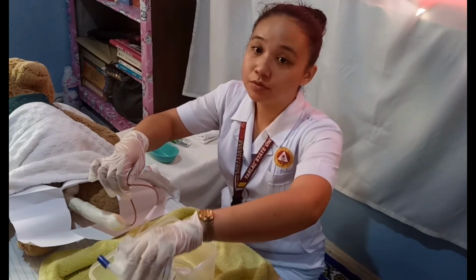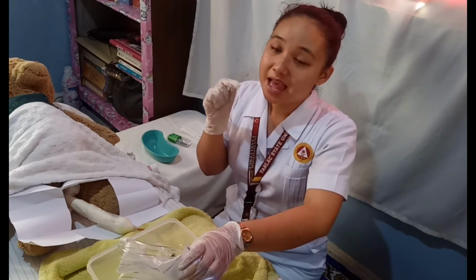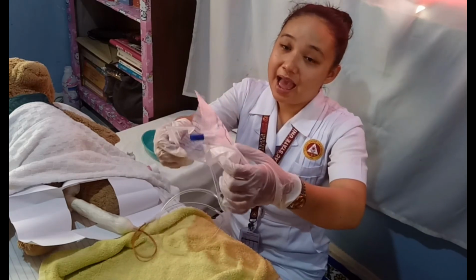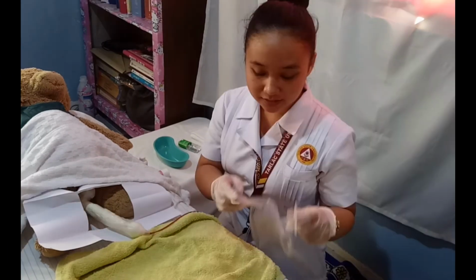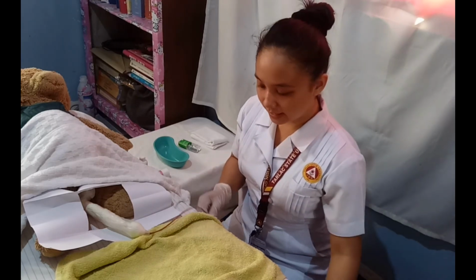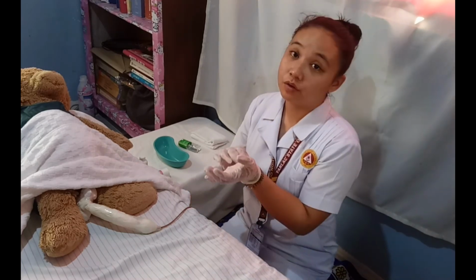Then you need to check that the drainage tubing is not kinked, and that movement of the side rails does not interfere with the catheter or drainage bag. You need to hang the catheter bag below the bed. Let's say, for instance, I already put the catheterization bag below the bed, and now we need to remove all the equipment, clean the perineal area, and remove also your gloves.